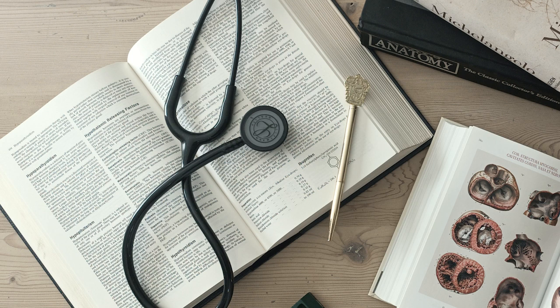Let's break down atrial tachyarrhythmia specifically, starting with atrial flutter. What are its characteristic ECG features, and what's the clinical presentation? In atrial flutter, the ECG will show those multiple regular small waves, not P waves, which are actually flutter waves, F waves, often described as a classic sawtooth pattern, particularly evident in inferior leads, II, III, aVF, and sometimes V1. The key here is their regularity and very rapid atrial rate, often around 250 to 350 BPM, typically close to 300. Regular sawtooth F waves, got it.